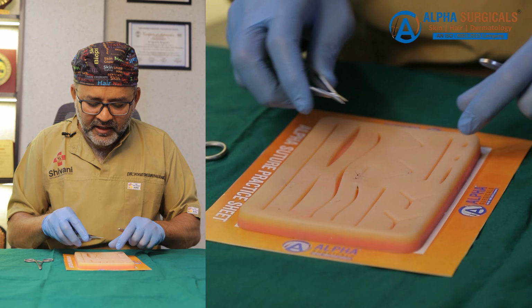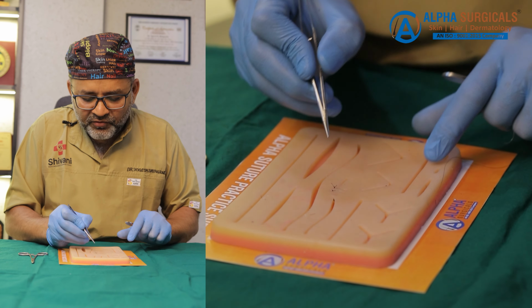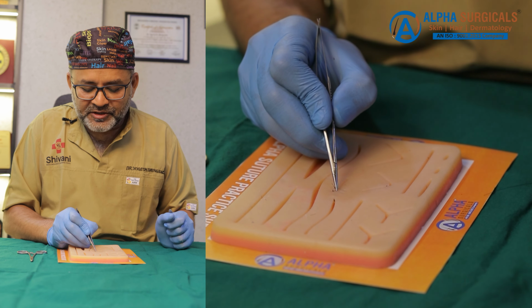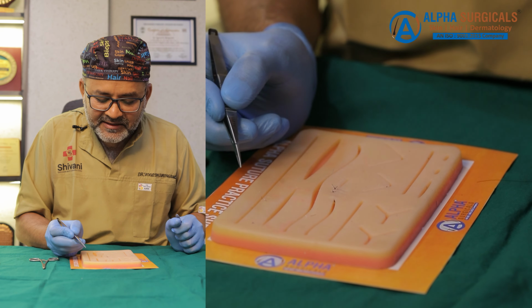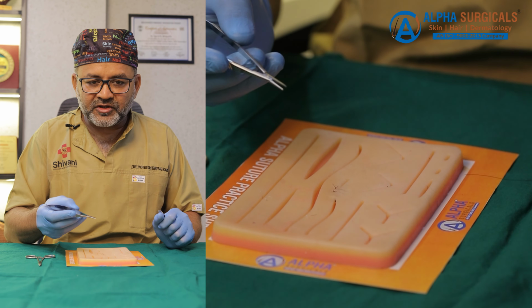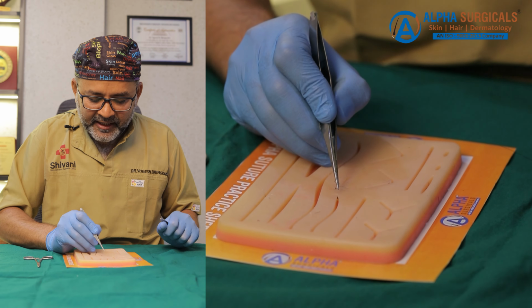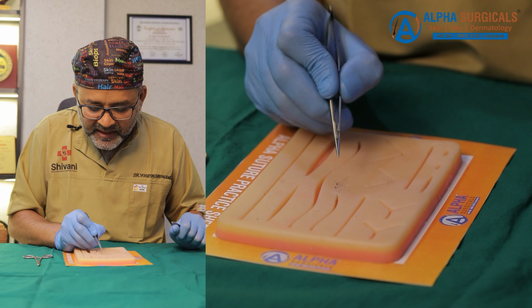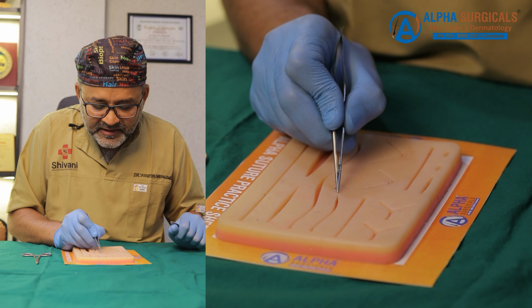So if you analyze the surface after giving intradermal stitches, now we can see the margin is exactly in apposition. We cannot see the end of the thread outside the surface because we cut the end of the thread just near the last knot given in the suturing technique, and the surface is closed, as well as there is no wound visible here, and the margin is in apposition.